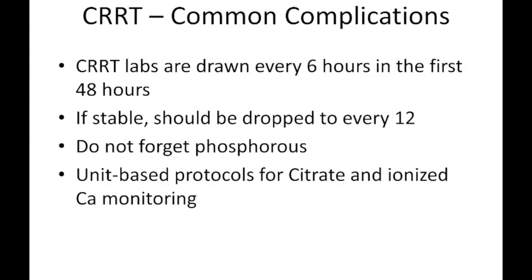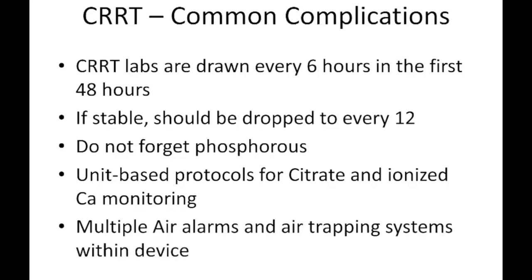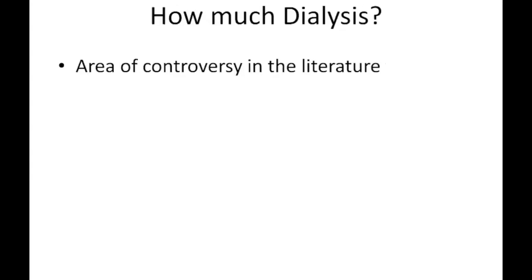Each unit, whether that's MICU, SICU, CCU, has their own individual protocols for citrate and ionized calcium monitoring, though we've attempted to standardize that and given all units a standard protocol. Some still do it their own way. And as we said, there's multiple air alarms and air trapping systems within the device.